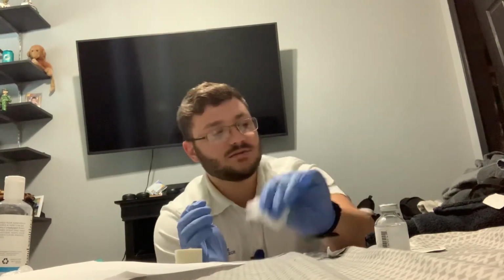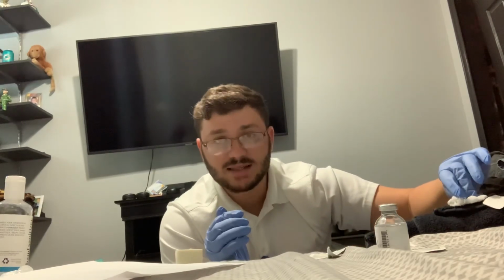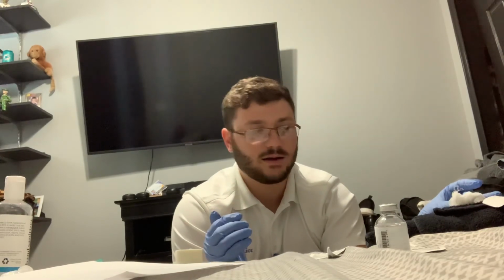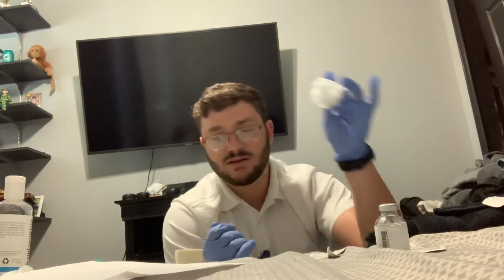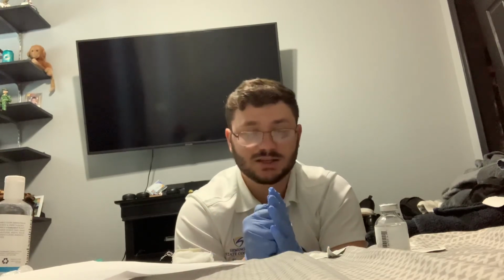I'm going to remove my gloves. Well, before I remove my gloves, if there's any bleeding, I'm going to want to apply pressure with the gauze that I may have. And then if there is more bleeding, or if there is bleeding, I can always apply a Band-Aid afterward. I've applied pressure, removed it, thrown it in the biohazard container, and I'm going to apply a Band-Aid, and then I can remove my gloves. So once I remove my gloves, I'm going to want to document that I have finished administering the medication.